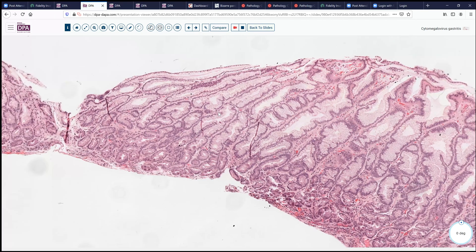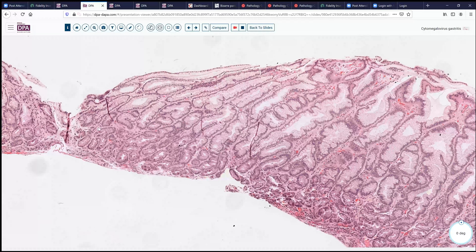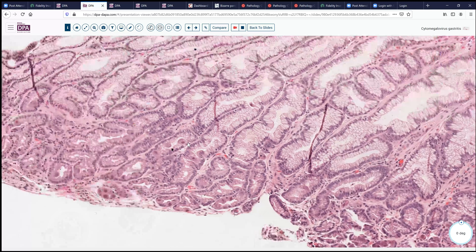These foveolar cells look quite striking with fairly ample amounts of mucin. But at this magnification, you can start to see maybe there are a couple of clues down here in the deeper antral-type glands. We can see there are some differences in some of these cells, so we'll go down and take a quick look at these.